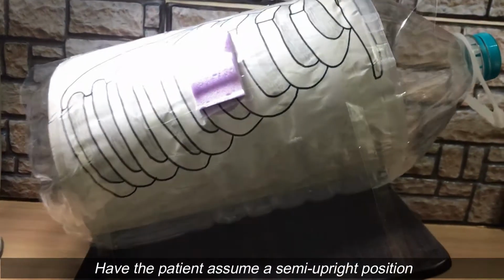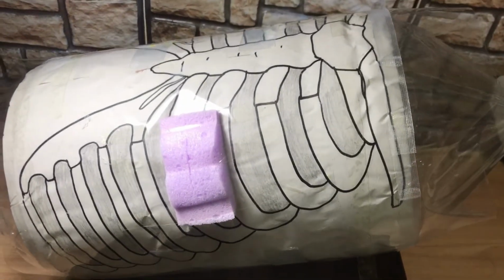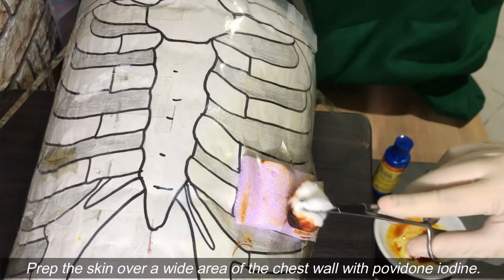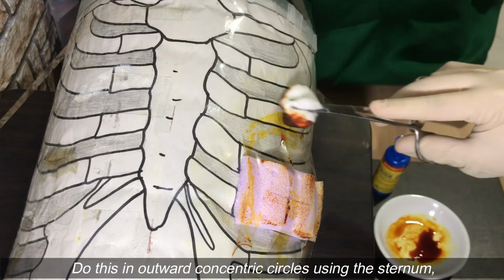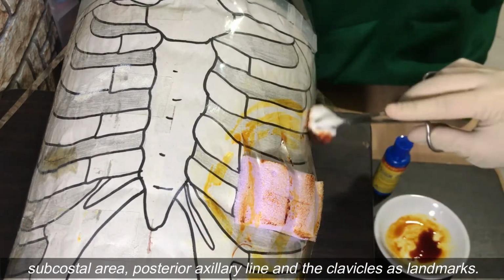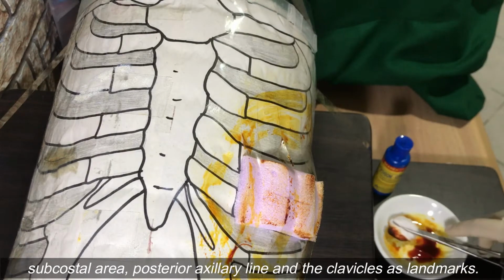Have the patient assume a semi-upright position with the arm above the head. Prep the skin over a wide area of the chest wall with povidone iodine. Do this in outward concentric circles using the sternum, subcostal area, posterior axillary line, and the clavicles as landmarks.